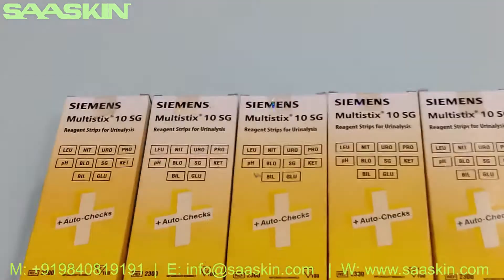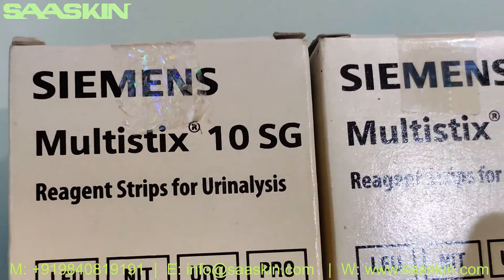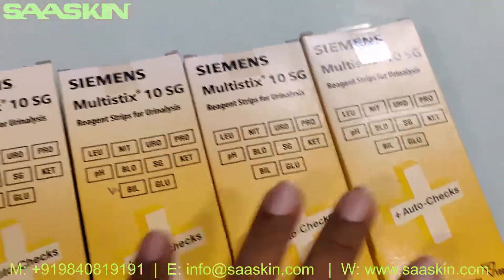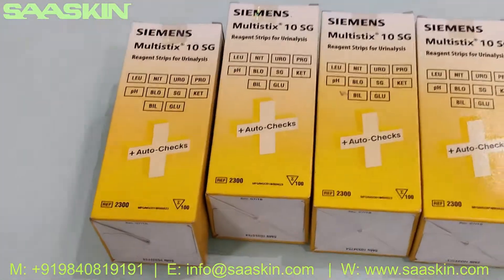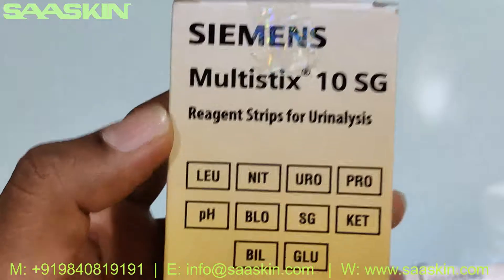Hello everybody, today we're going to see the unboxing of the Siemens Multistix 10SG urine analysis strip. I'm going to show you how the box looks like — we have five boxes here. I'm going to take one box and unbox it for you and show the contents inside. This is typically how the box looks like.